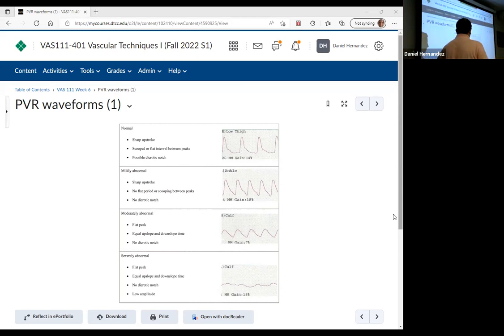This is a kind of a better example. At my lab in New York, we described it as normal, mildly stenotic, and then occlusive. Those are the terms that we used. I know at Christiana, they like to use normal, loss of dicrotic notch, dampened, and then occlusive. I don't know why there's not one standard, like this is what we call it and that's it. I know.